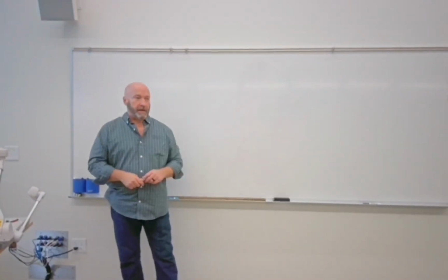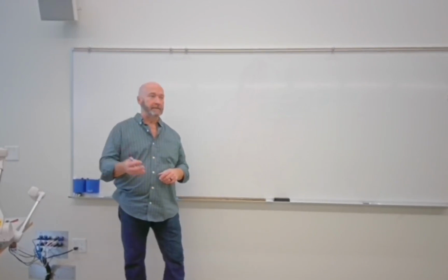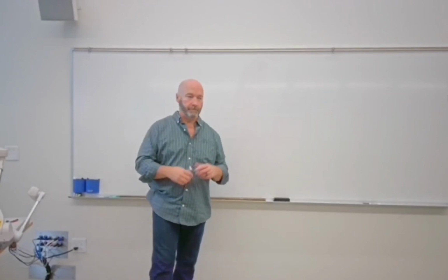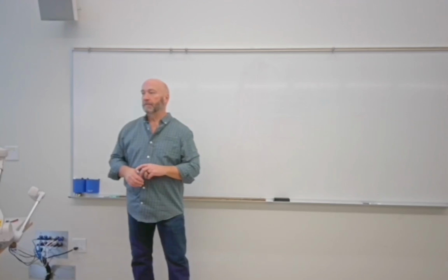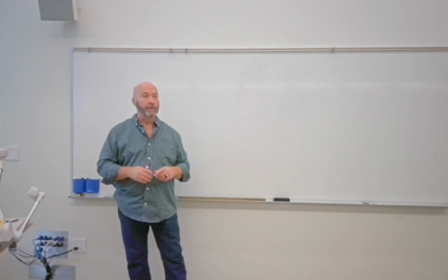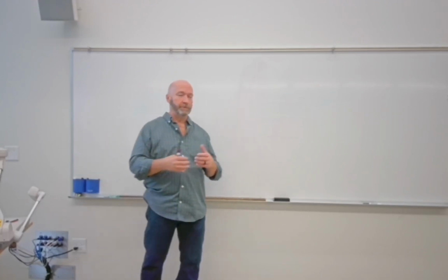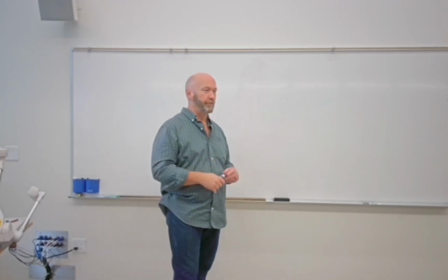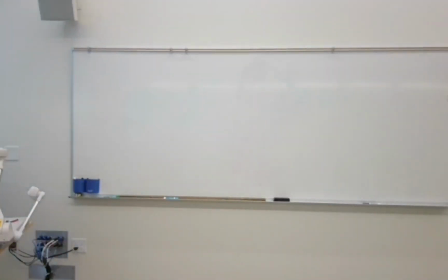And what we do in diagnostic, energy type, it could be diagnostic where we're taking plain film radiography, or it could be fluoroscopy, or it could be a combination of both. And it will be an RF room, radiology and fluoroscopy room, where you can do pretty much everything, and that's what you refer to as a general purpose room. So we talked about all that. We kind of skipped around a little bit, but we're going to go back and pick up some things.